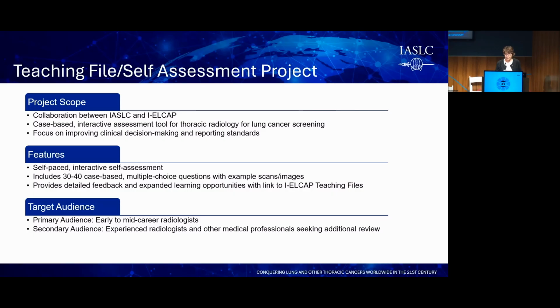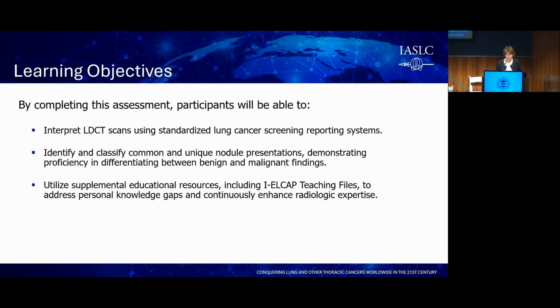So it's self-paced. It will include approximately 40 multiple choice questions, and it provides immediate feedback. At the end of my talk, I will show you screen captures from the actual system that we're going to use. And in addition to people who are just learning to read the low-dose CTs for the first time, it can also serve as a review for experienced radiologists and other medical professionals who are interested.